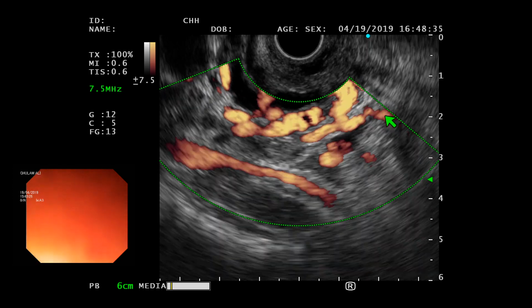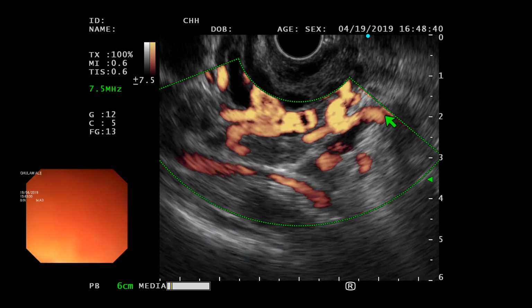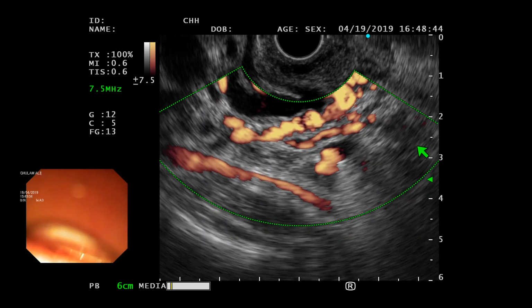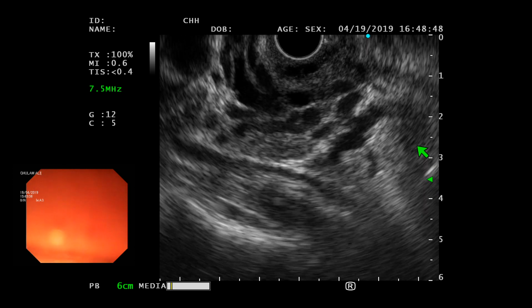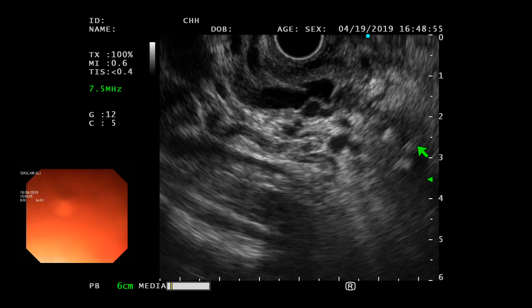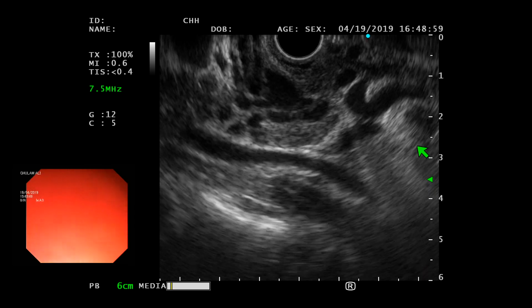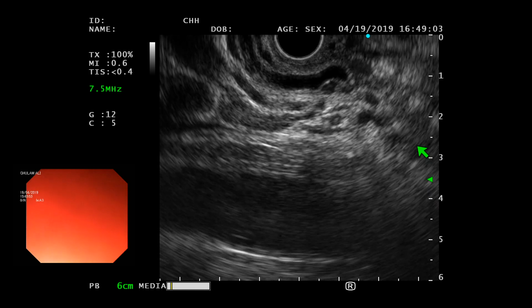So if you still are far away from the pancreas actual. So this is a portion of it right here, this one. Keep going to the right. It may not be possible, honestly. Okay, it's all because of so much distortion of the duodenal bulb by that mass and everything. And it may not happen.